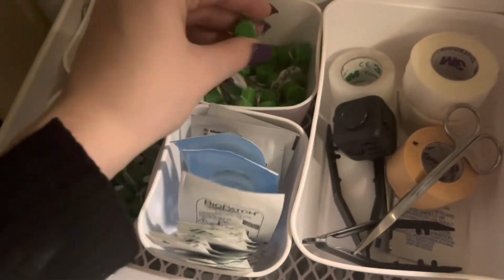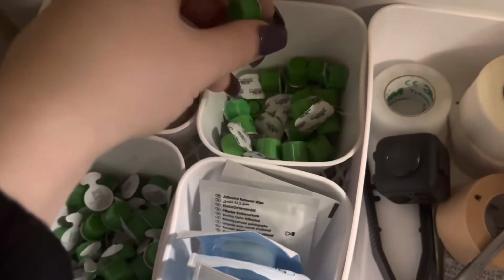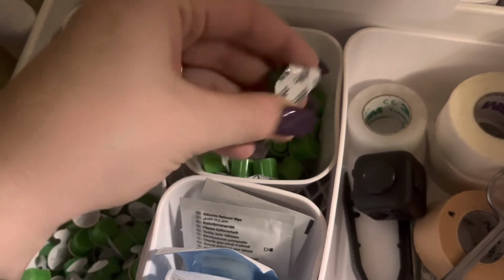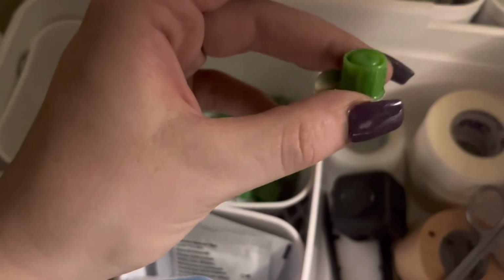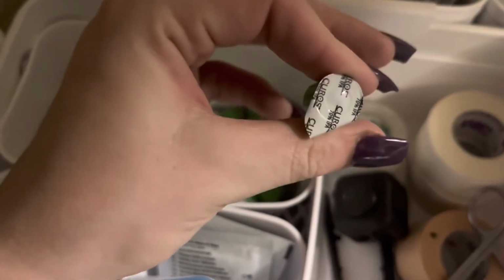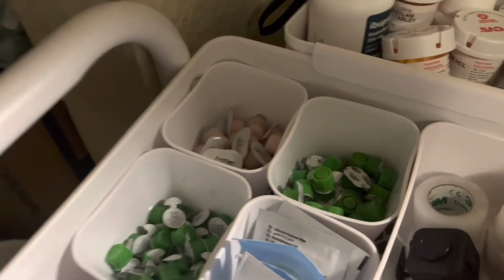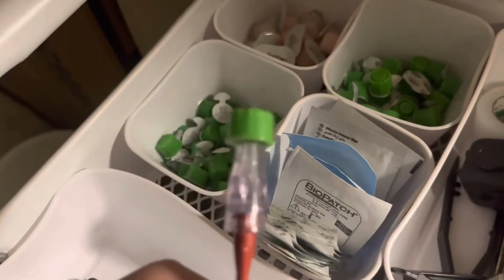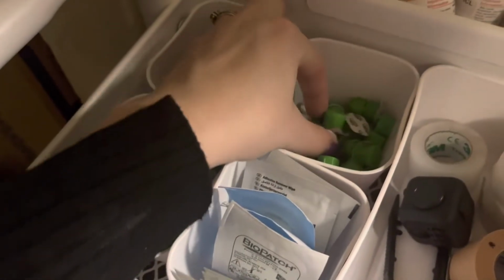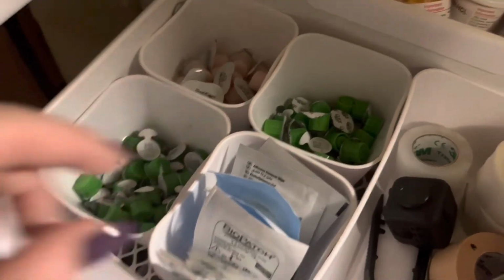And then I put my caps in the wrong place, or maybe Charlie mixed them up, I don't know. These caps I don't like very much because they're hollow. They don't have any gauze, just plain solution inside. But these ones are my favorite, and they look like this on the end. These are just the plain green ones, which are bigger, and I like the smaller caps.